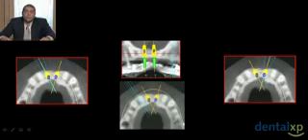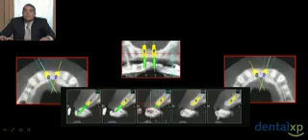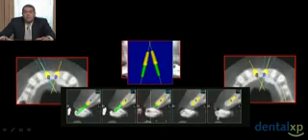So let's take a look at this particular patient over here, and take a look at as we cross that panoramic curve or processing curve, we see that the path and orientation of the cross-sectional image, as represented by that blue line, takes a different orientation. So what's the significance of that going to be? Well, if we put each of these implants in parallel to each other, but now we rotate each one of those implants the same number of degrees buccally, what we're going to find is that when we look at those in a three-dimensional reconstruction, the implants actually become divergent.